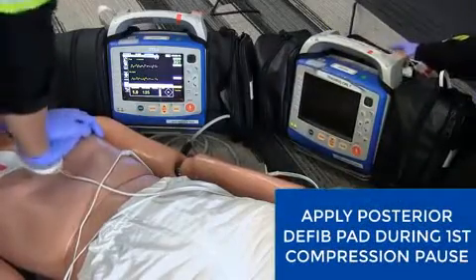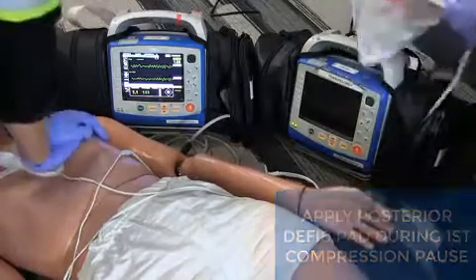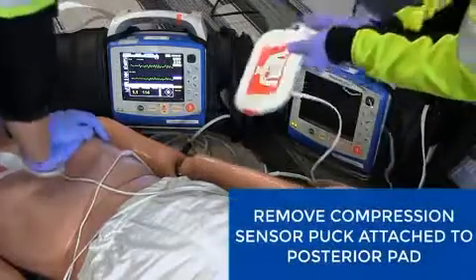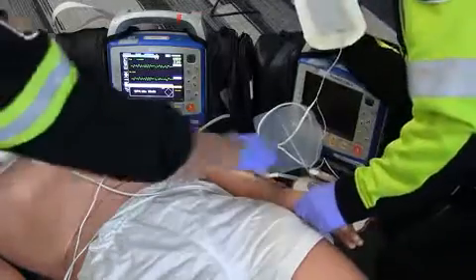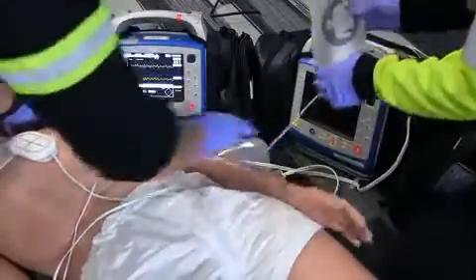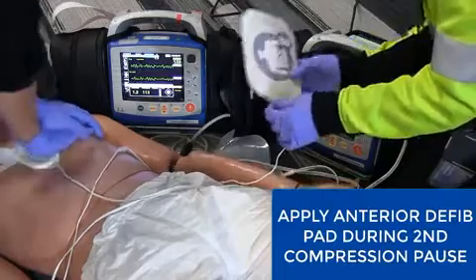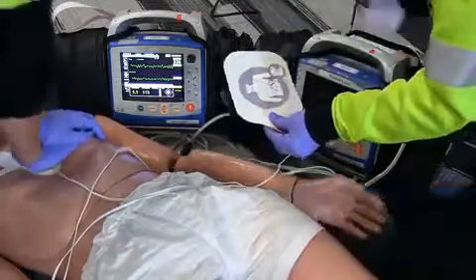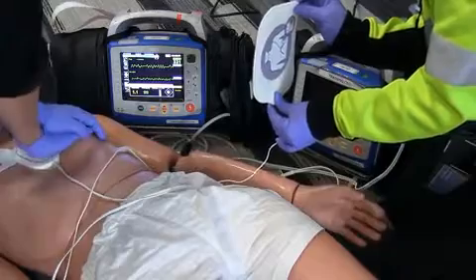After your 30 compressions and two ventilations, we're going to apply the posterior pad. Apply the posterior defibrillation pad of the second monitor during the first compression pause. Remember to remove the compression sensor. After your next 30 compressions and two ventilations, we'll apply the anterior pad. Apply the anterior defibrillation pad of the second monitor during the second compression pause.